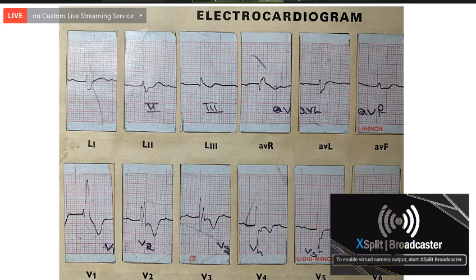So all put together, what is your diagnosis? Trifascicular block. Why is the patient having a right axis deviation? Left posterior hemiblock. Yes, very good.